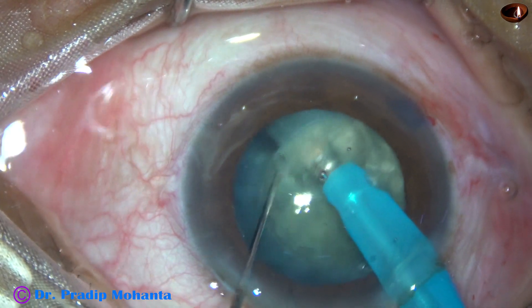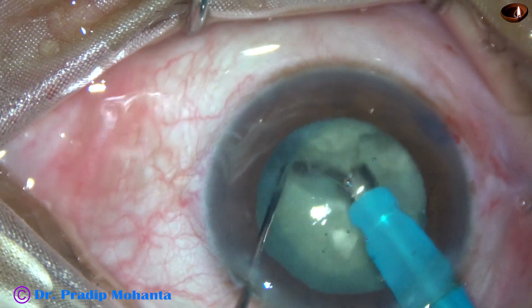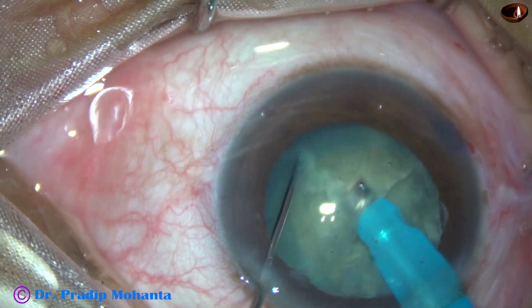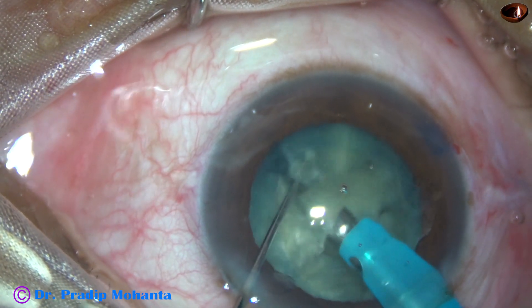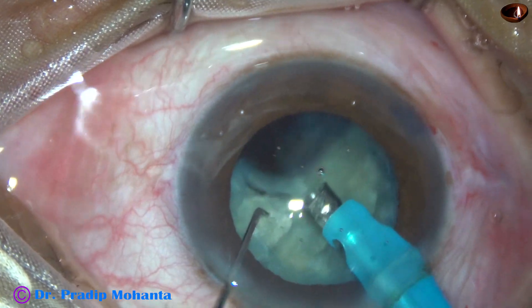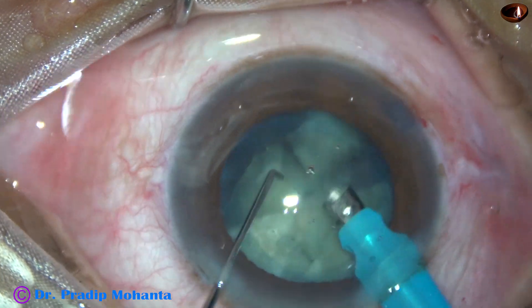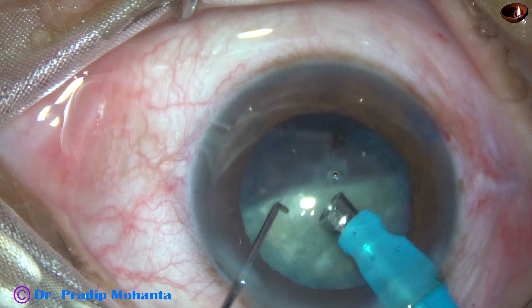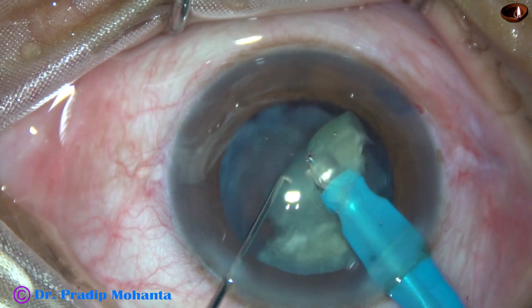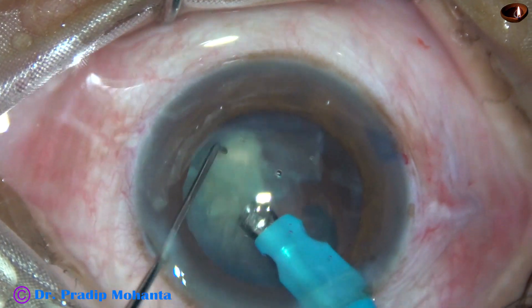To divide the nucleus into two hemi-nuclei, each hemi-nucleus is subdivided into two large fragments, and then each nuclear fragment is emulsified with ultrasonic energy, which is 65% in this case. Flow rate in this surgery is 45 ml per minute, vacuum is 450 mmHg, and the machine being used is Alcon Centurion.